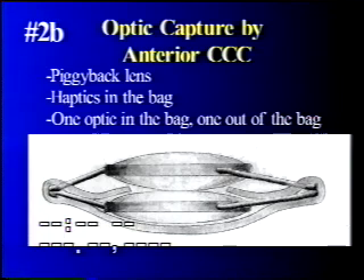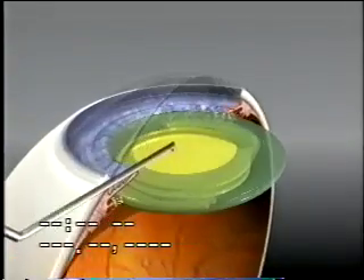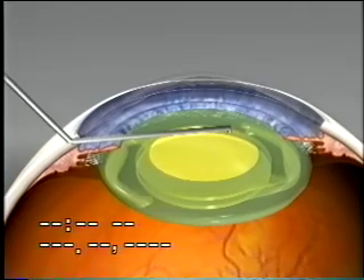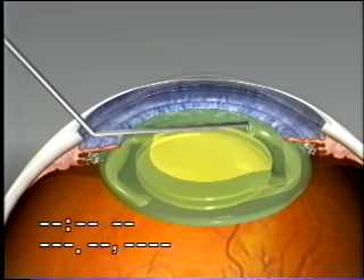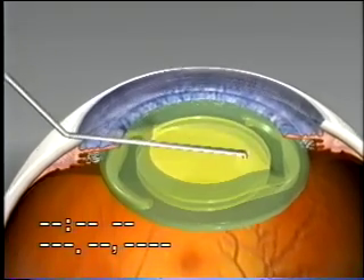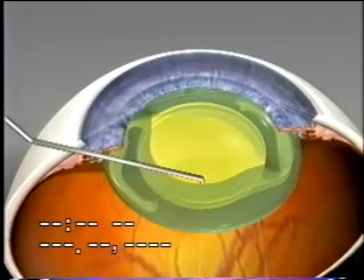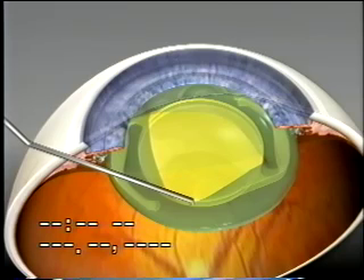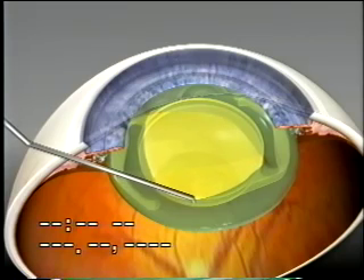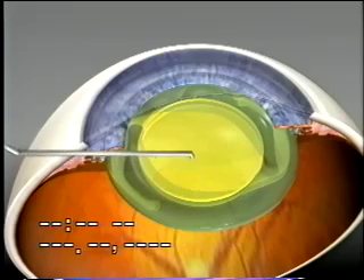A variation of the second option is when a piggyback lens may be necessary. Rather than leave both optics in the bag, the second optic can be pulled out of the bag leaving the haptics in the bag. This would avoid the development of pearls and membrane between the two optics, because the pearls will spill out into the anterior chamber. You can see the haptics are all in the bag but the second optic is pulled out to be captured by the CCC.